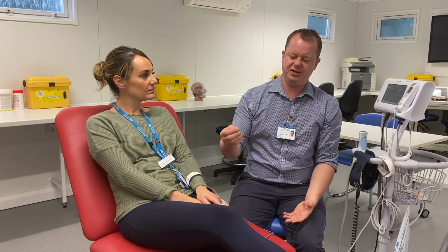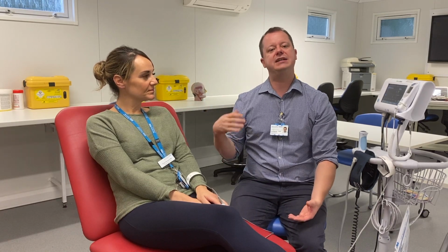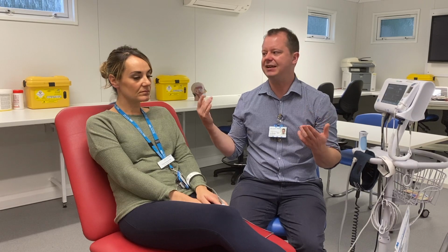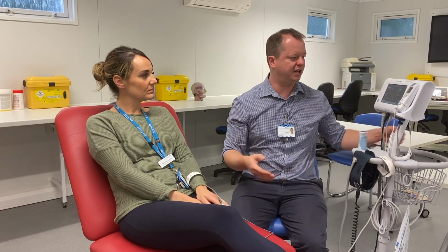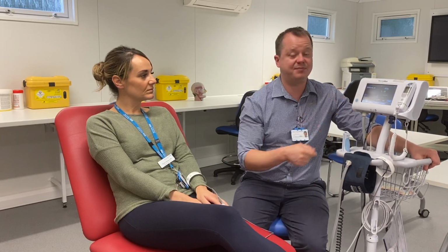So it's important to figure that out. People do decide to try and use these SATS probes in weird ways, like they try to record on the ear or the toe. They're not really designed to do that. It is possible technically, but they're meant to be used on the finger, so that's where we're meant to be recording it. As you can see, Tina's saturation of oxygen is 97%, which is great.